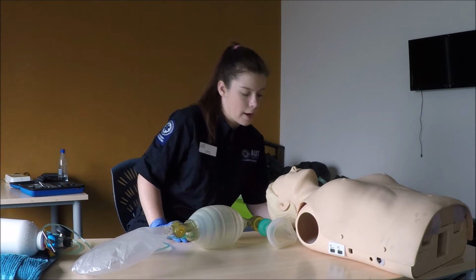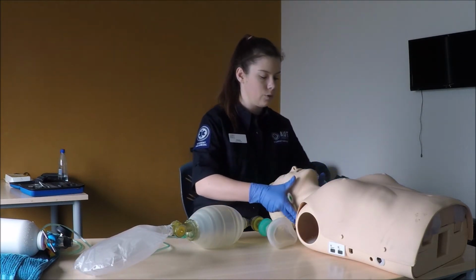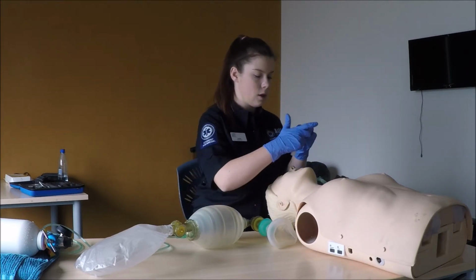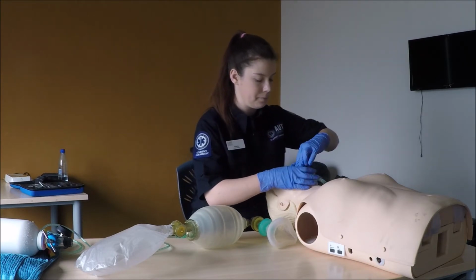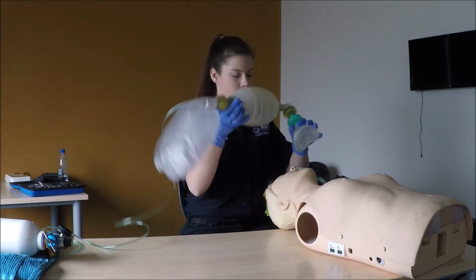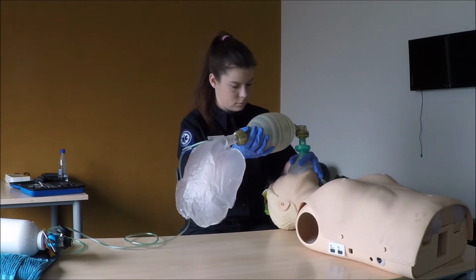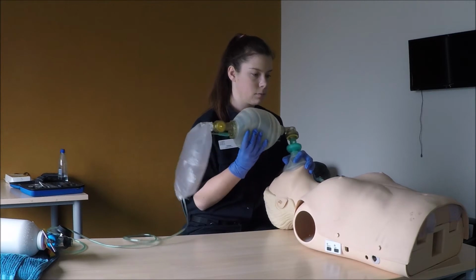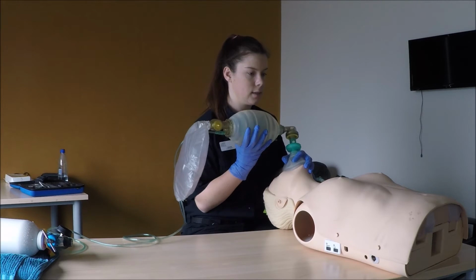Before we apply oxygen to the patient, we'll insert an OPA. First, I'll use a head tilt chin lift to open the airway, and then insert the OPA, rotating 180 degrees. We'll now apply the mask to the patient's face using a C-grip, and then ventilate the patient every 5 to 8 seconds, checking for chest rise every time to make sure that it's effective.